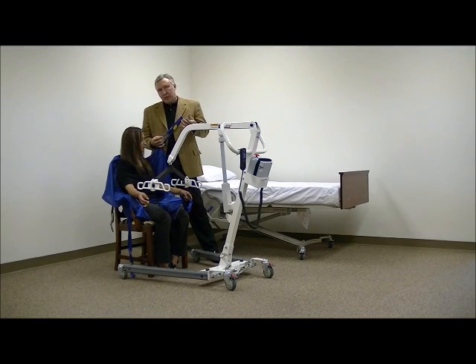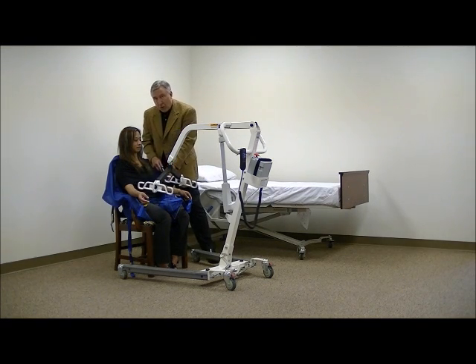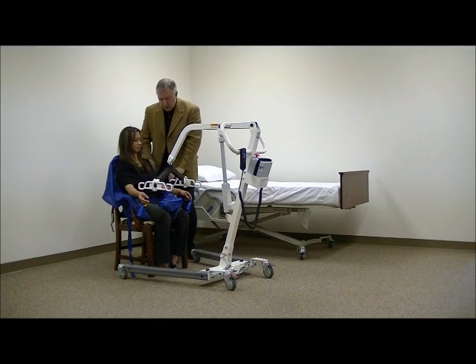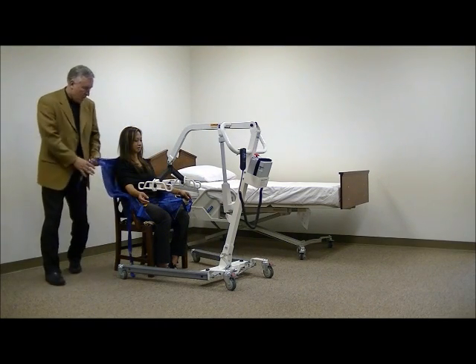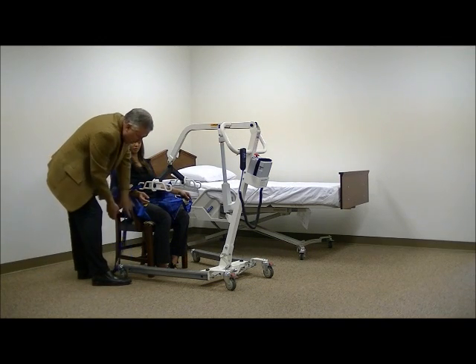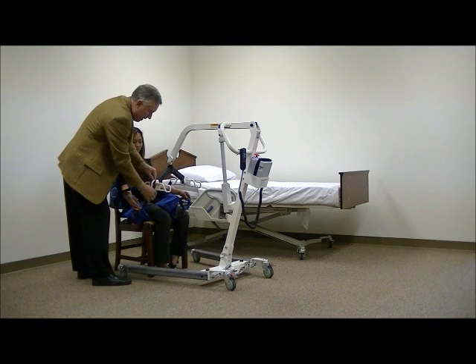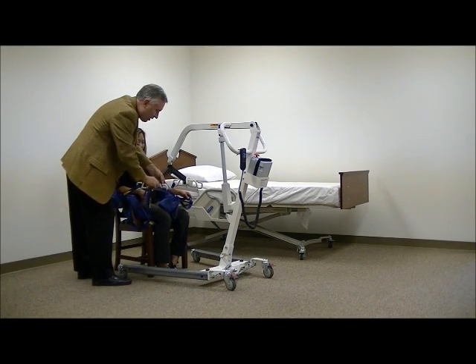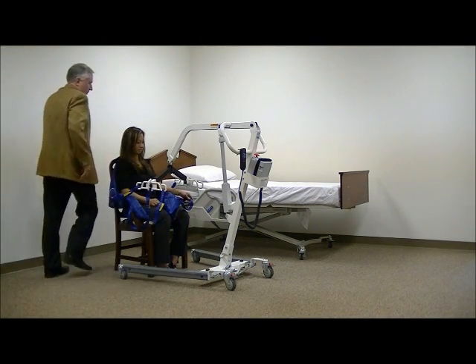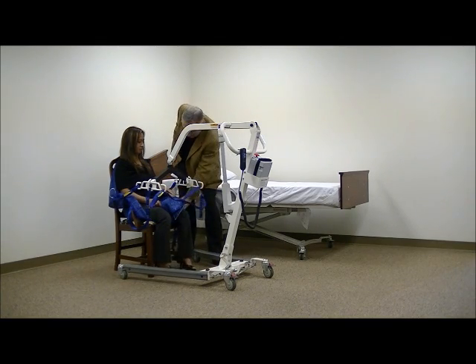Now you see these loops here? What I'm going to do right now is I'm going to put my patient in a lying down position, and the way I'm going to do it is I'm going to attach the loop that's the furthest away from the sling on the shoulders, the furthest away on the middle, and the highest on the leg. That will allow me to recline the patient back while I raise them up.